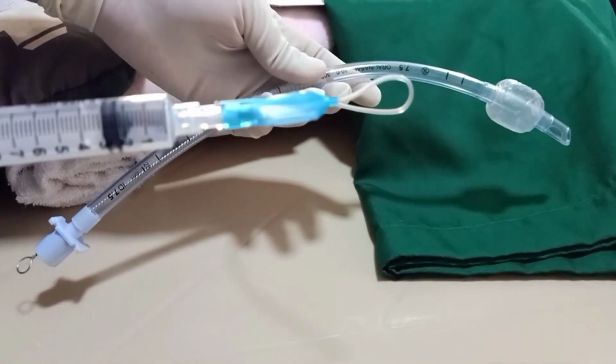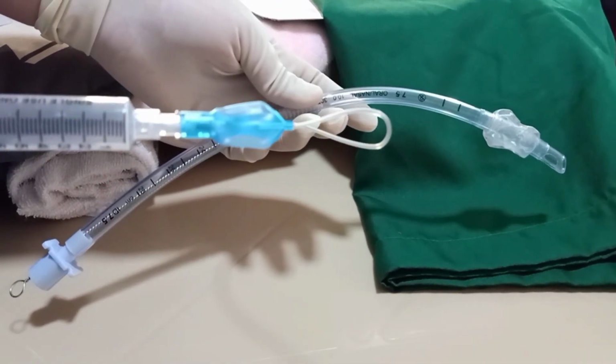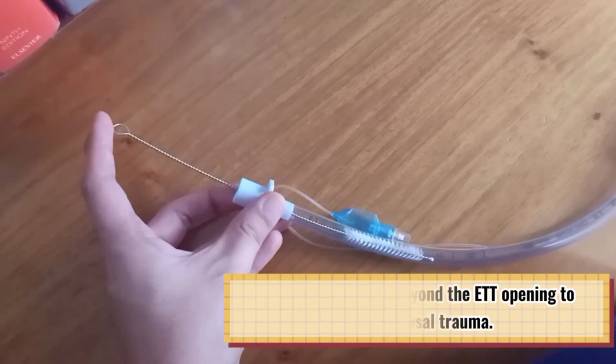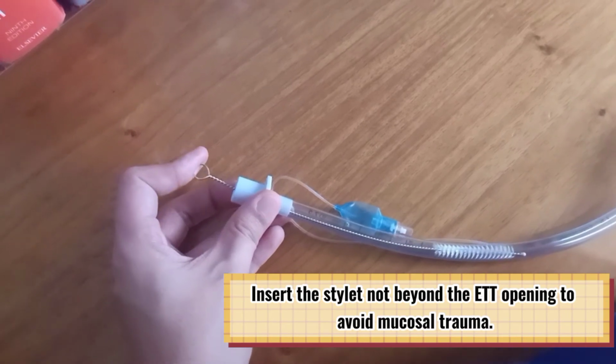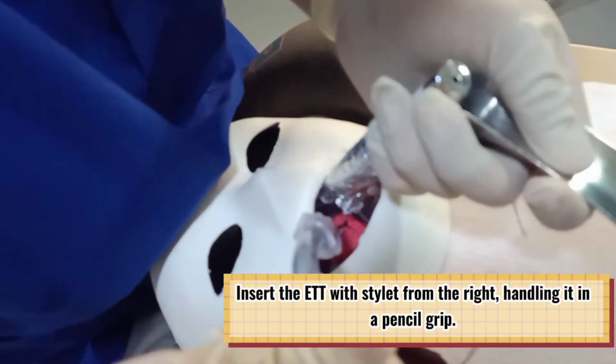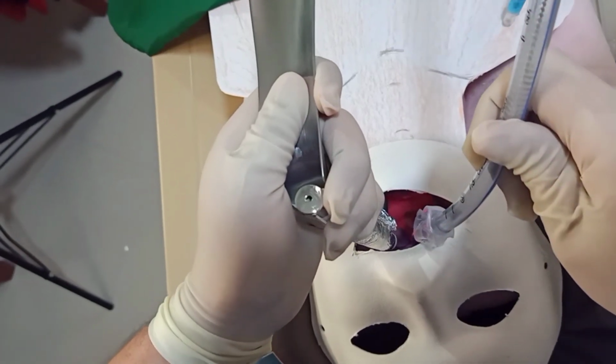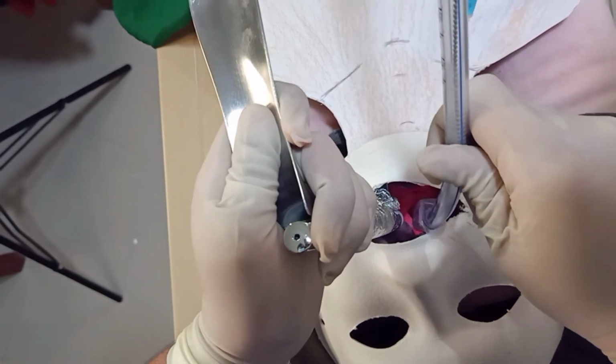So deflate it again and apply the lubricant and insert the lubricated stylet to a point beyond the cuff but not beyond the opening in order to avoid mucosal trauma. Insert the endotracheal tube with stylet from the right using the right hand while holding it in a pencil grip, and make sure it doesn't block the view of the glottis.